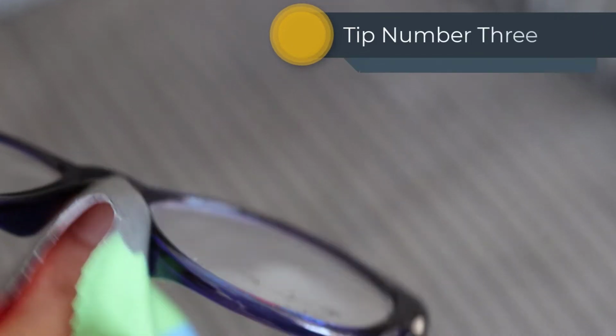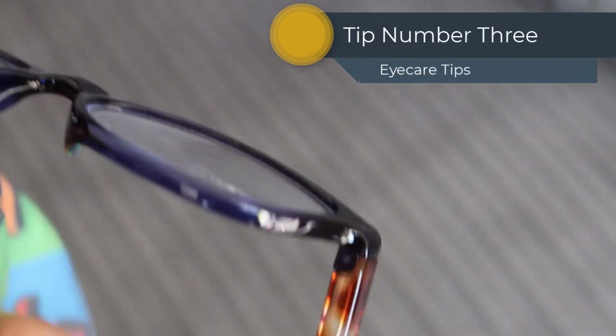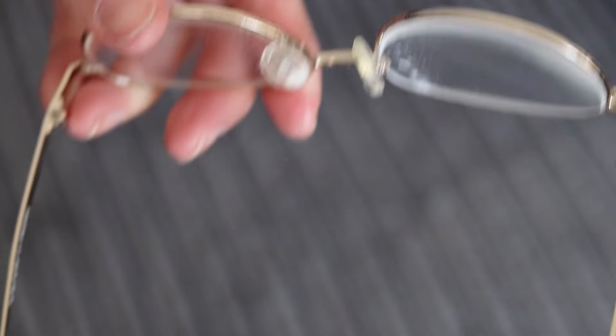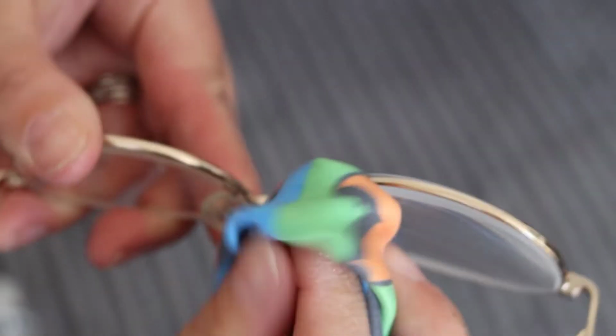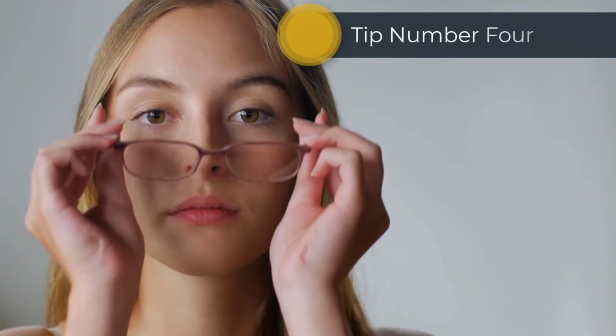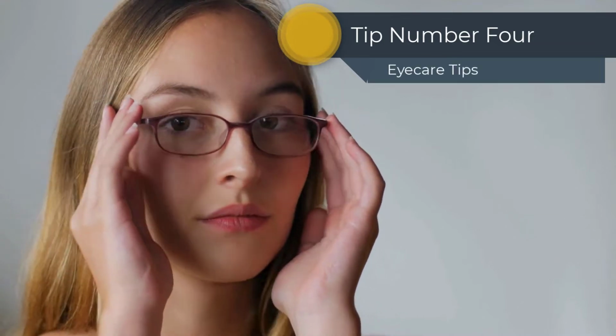Tip number 3 is that the area of the frame which rests on your nose can absorb dirt, dust, makeup and other natural oils, especially if you have nose pads, so regular cleaning is essential. If you feel that your spectacles need a more dedicated clean, just pop them in and we can clean them for you.